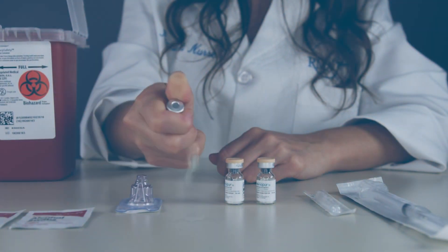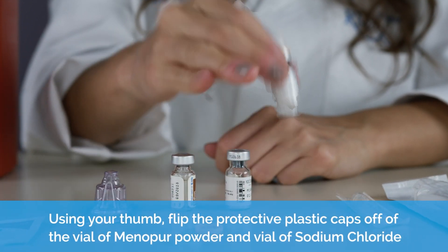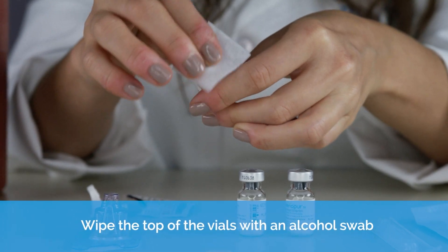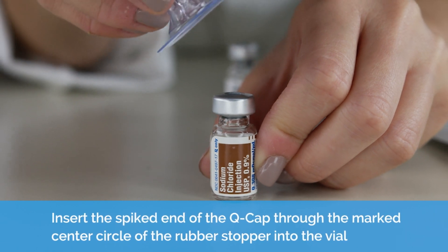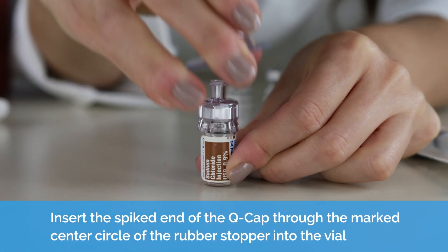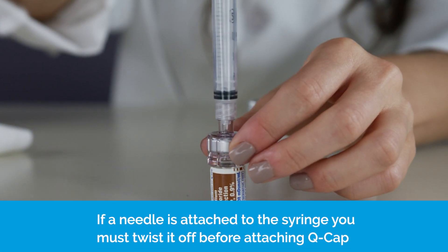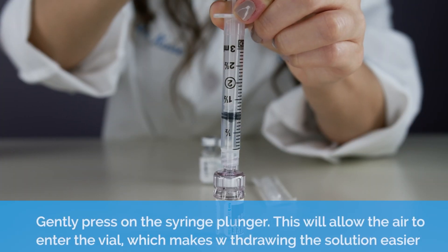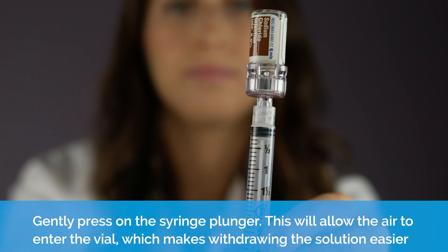Mixing. Wipe the top of the vials with an alcohol swab. Remove the paper backing of the Q-Cap. Twist the syringe onto the Q-Cap. Gently press on the syringe plunger — this will allow the air to enter the vial, which makes withdrawing the solution easier.